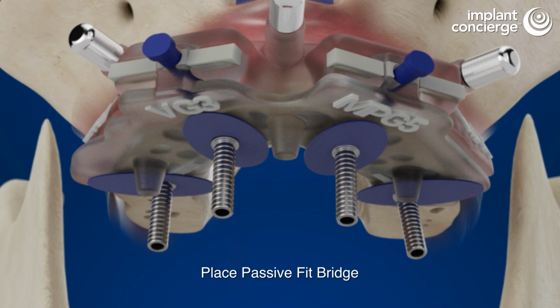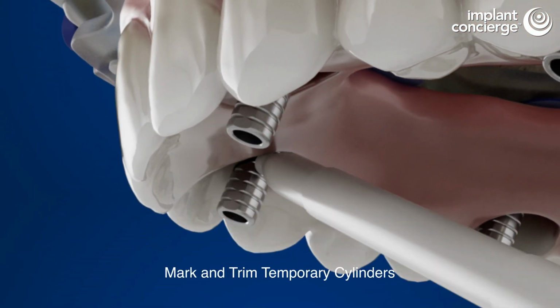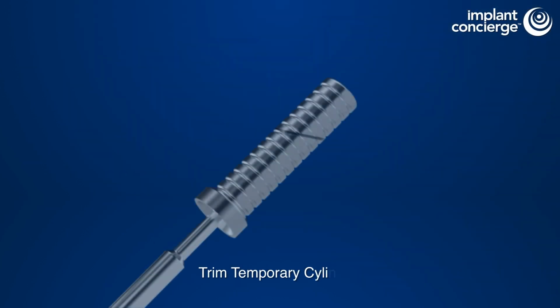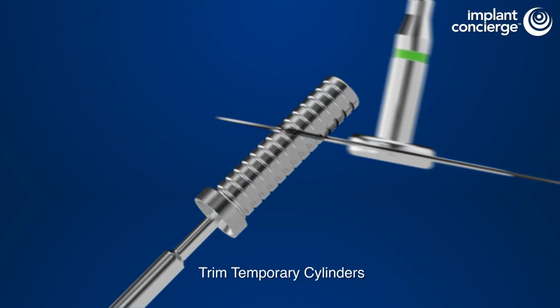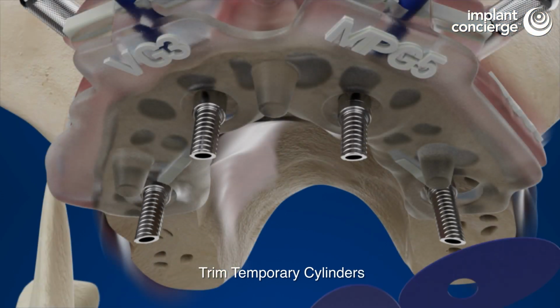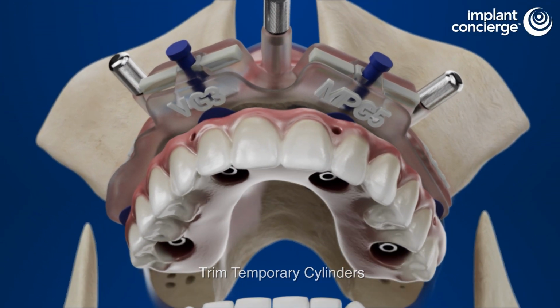Position the passive fit bridge over the indexes of the multi-purpose guide and mark temporary cylinders to match the contour of the passive fit bridge. Remove and trim the temporary cylinders before delivering them. Refit the cylinders and the passive fit bridge. Use the material of choice to block out the screw access channel opening.